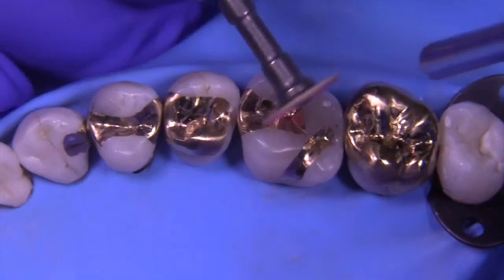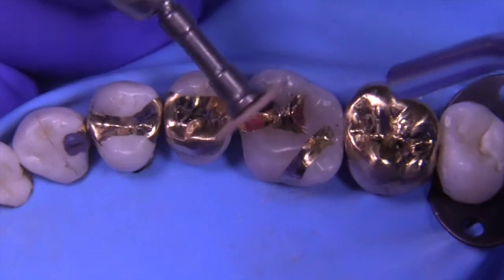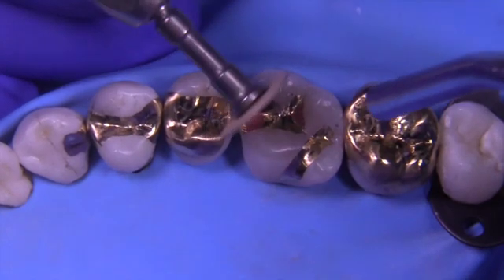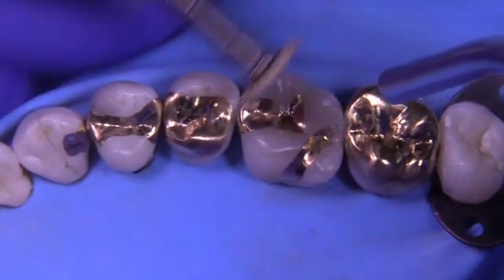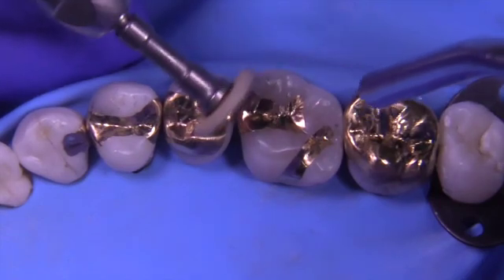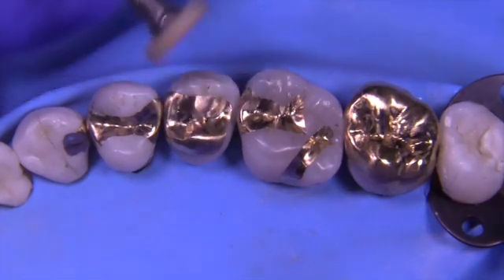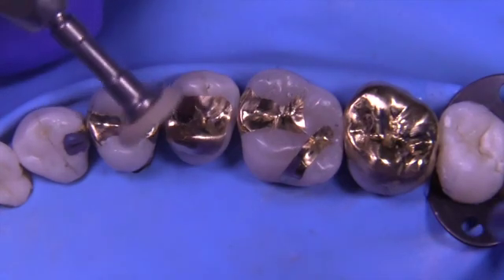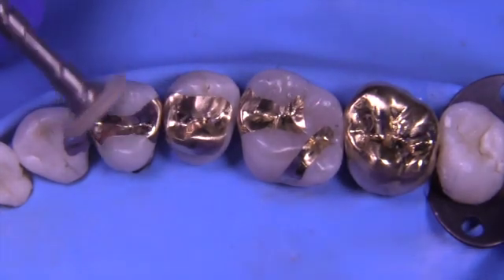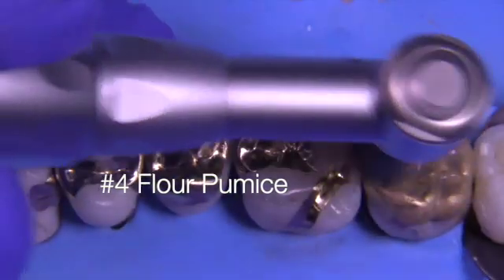You can utilize a brownie, a greenie, and a super greenie to refine any scratches in the grooves. Sometimes they're helpful for inaccessible areas — interproximally, at the gingival margin corners with the lingual or facial surfaces — where you can't quite get a disc to fit. It's nice to have abrasives like that available in your polishing system. Now let's start with the flour pumice number four.